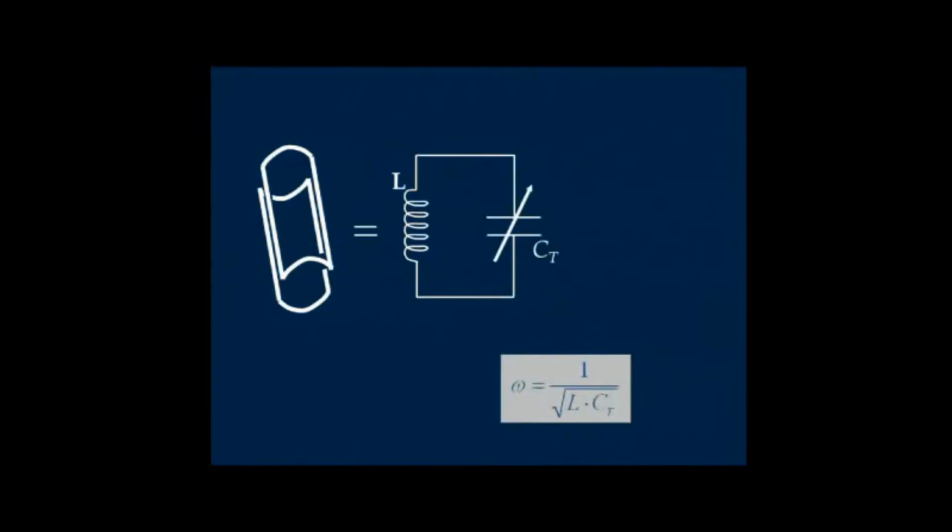To begin with, we have to clarify two things. First of all, coil. In the physics world, a coil is nothing else than a wound wire represented by an inductance L. In the world of MR, a coil is a resonance circuit. So when MR people talk of coils, they always mean a resonance circuit, which includes a capacitance as well, and which leads to a resonance frequency of the whole circuit.